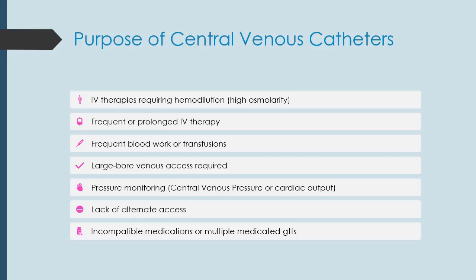So before I continue, I just want to get a disclaimer out there. You're going to hear me use both the term central venous access device and central catheter. I mean the exact same thing. So if you hear me using those interchangeably, that's why.